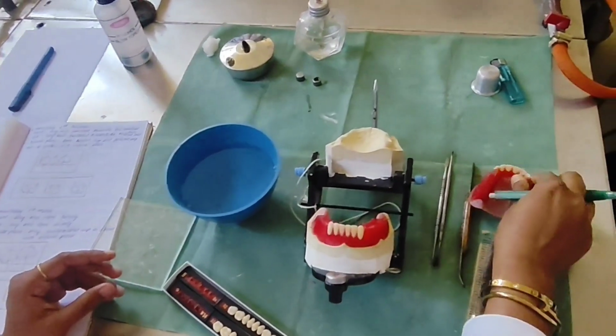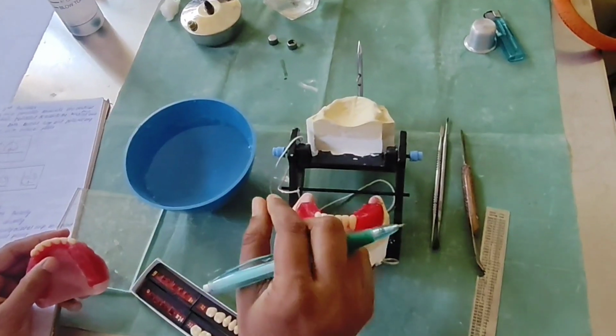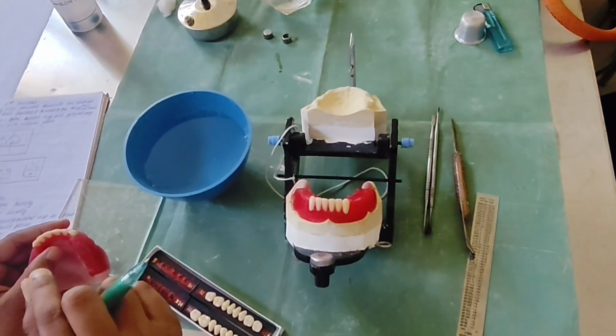You have to understand which is mesial and distal. Make sure when you are arranging, whenever you are keeping it back or arranging it, at that time only you be sure and arrange. Don't get confused with it. Okay?